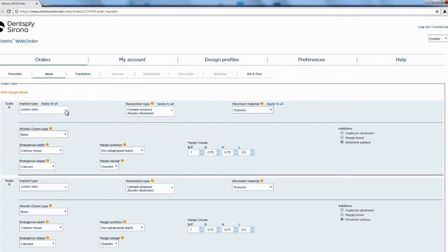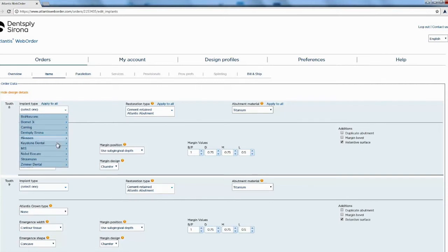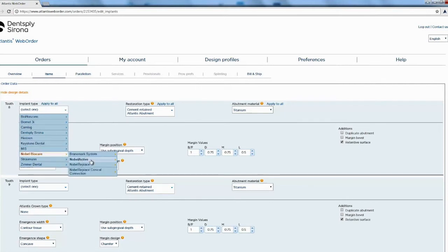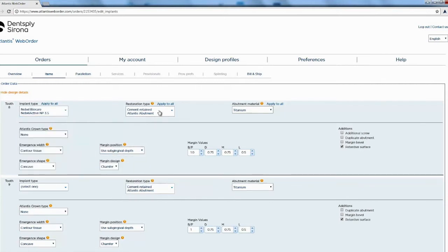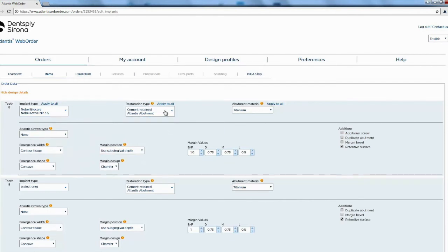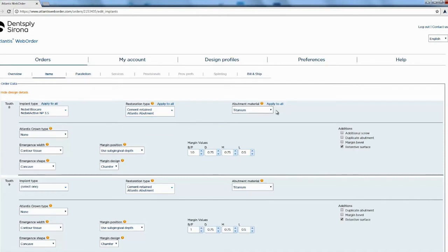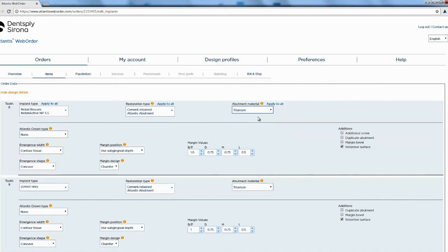All right here we're going to put in the details of our implants. So this one was Noble BioCare, Noble Active 3.5. Then you're going to let them know do you want a cement retained, screw retained or attachment retained and then you can choose what type of abutment you want.